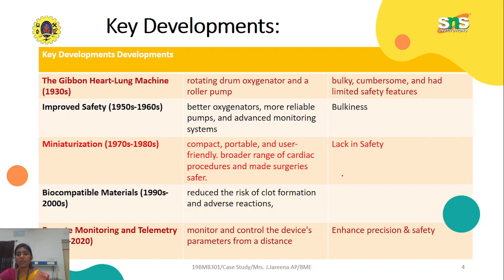Here the safety is not only data safety. Safety means, since it is a heart lung machine or external device, when you put this external device on the patient, we can't be sure whether the patient will accept this machine. There may be some bad reaction, an adverse reaction, which again becomes a limitation of use.